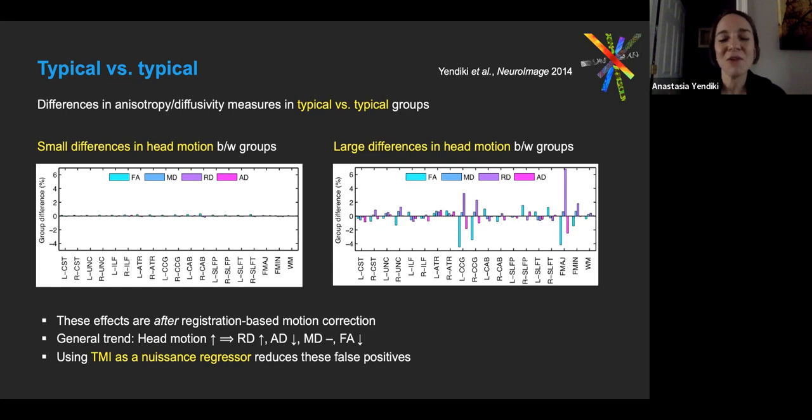But what I found, and I checked each one visually multiple times to give them kind of a grade, it was hard to find a threshold where you would throw out all the bad subjects and you would not throw out any of the good subjects. So it did not seem like it was easy to just throw out some outliers and get rid of this problem. It was more of a continuum.